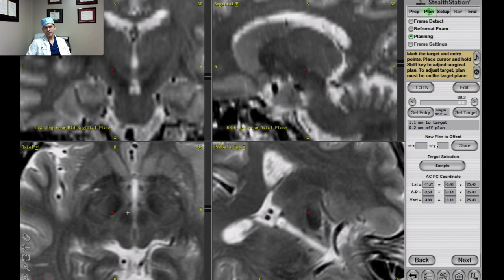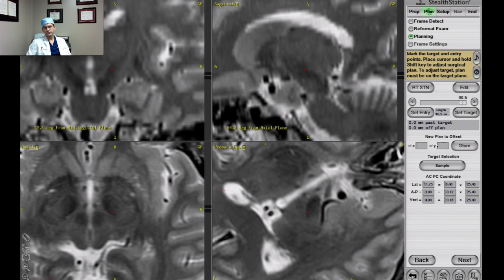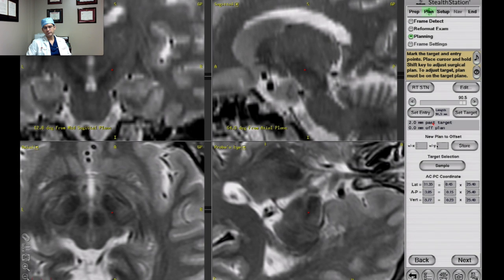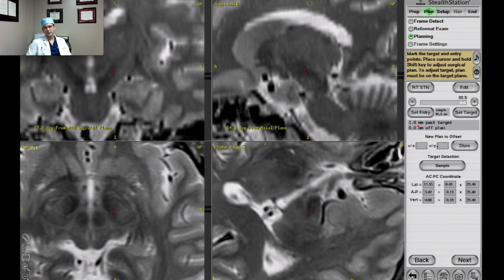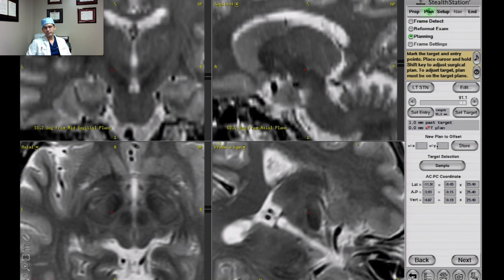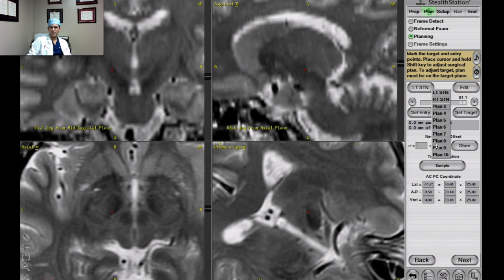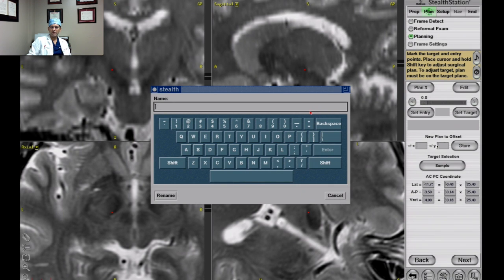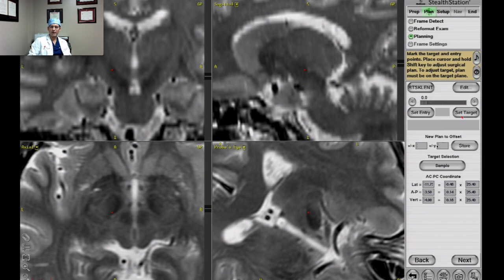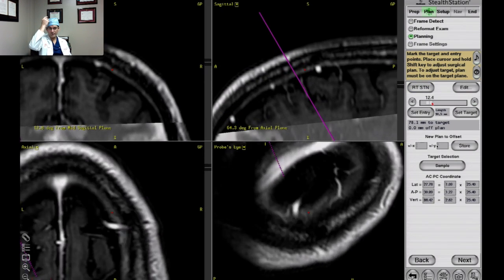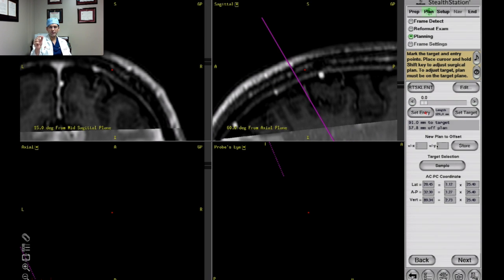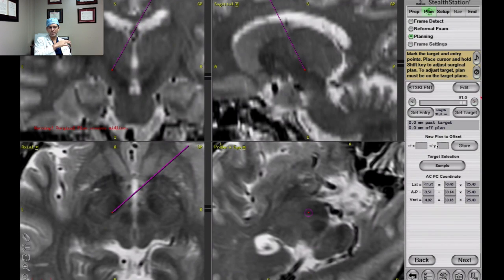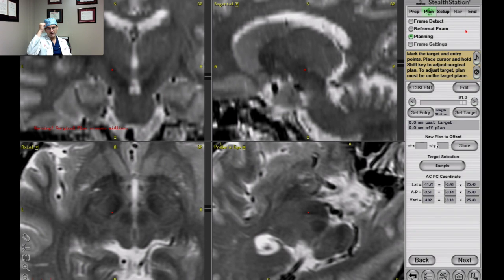We've been looking at the electrode's relative position to the red nucleus and looking two millimeters past target to see how we progress as we get deeper. The next step after this — I think we're done targeting — is that because I use the Leksell frame, one step I do is make an additional trajectory. In order to plan both incisions, I have a third plan called the 'right skull entry.' That targets the left side because I do the left side initially, so my initial frame setup is set for the XYZ coordinates of the left. But I make the entry point the point at which my trajectory hits the right skull — so it's a cross-midline trajectory.